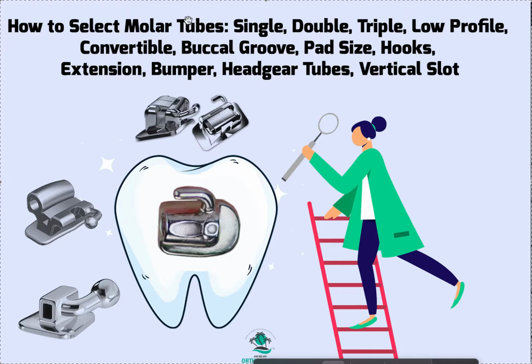What else? Now they've got single, double, and triple. For you guys, for the most part, for brackets, I think just get singles. They're just asking how many holes are in there. For example, if you look at this one, it has a slot here, or tube here. There's also another tube here. This one's square or rectangle, and this one is round.